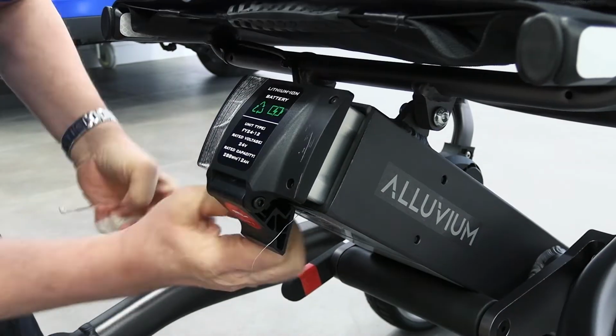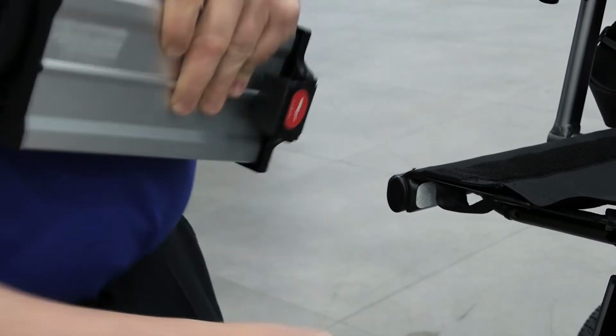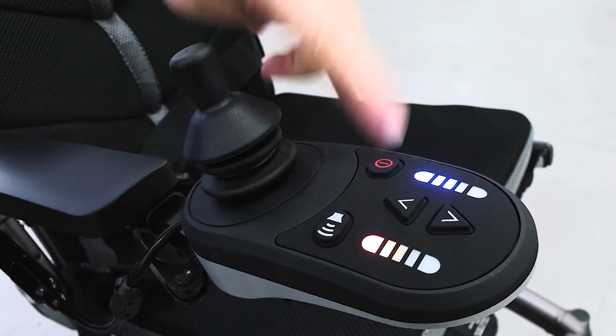Next, remove this tape on the underside to release the power chair battery. You'll need to remove any other wrapping as well as this small rubber covering on the underside to access the charging ports and to connect the battery to the motor.